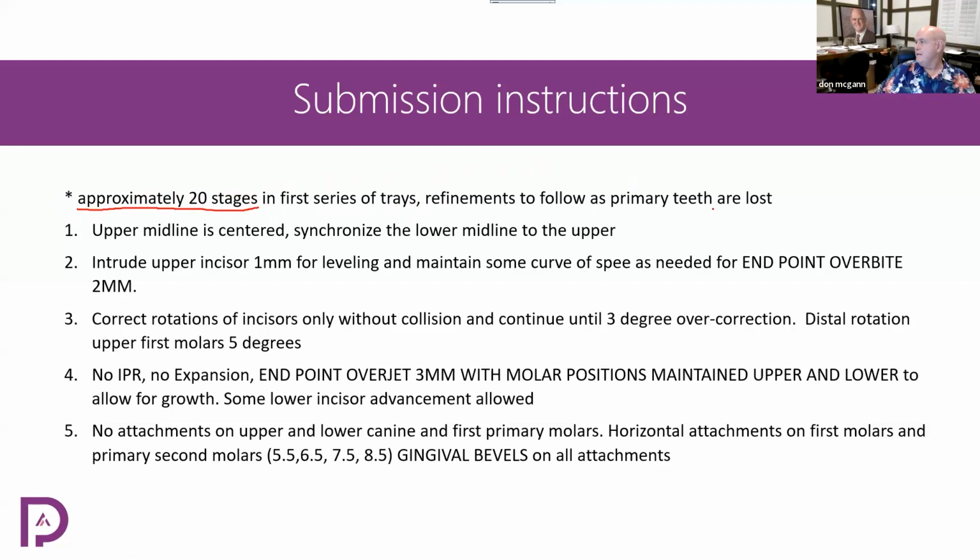You get that? This is what's going to set up the case for the future, and the reason why you can keep doing unlimited. You don't say, "Give me 100 trays for the next 5 years." No, give me 20. Then we'll come back. Give me another 20, or maybe 12 if you're going on a retention project, maybe with bubbles, okay?